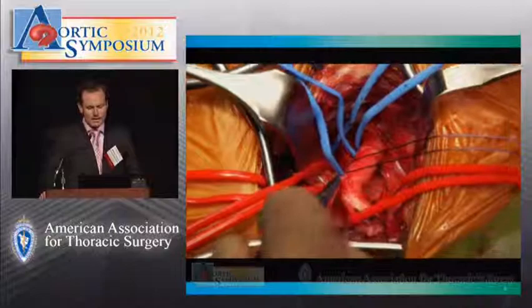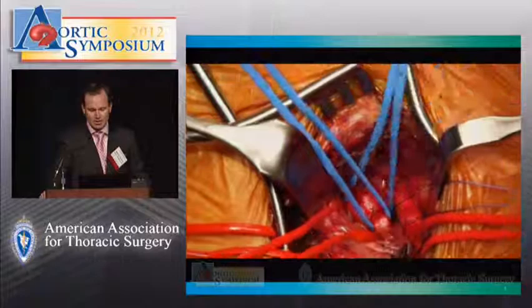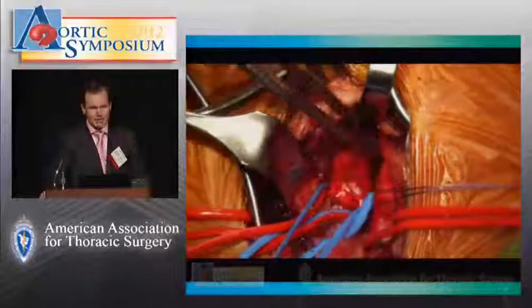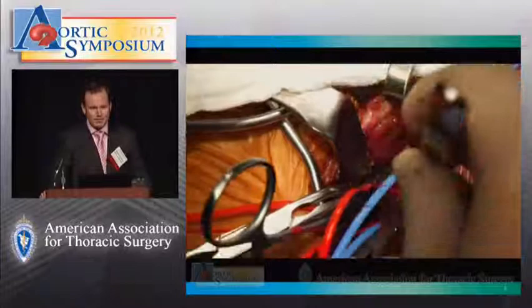We use a small supraclavicular incision and approach the vessel between the two insertions of the sternocleidomastoid muscle. We extensively prepare the left common carotid artery, the left vertebral artery, and the left subclavian artery down to the level of the aortic arch.